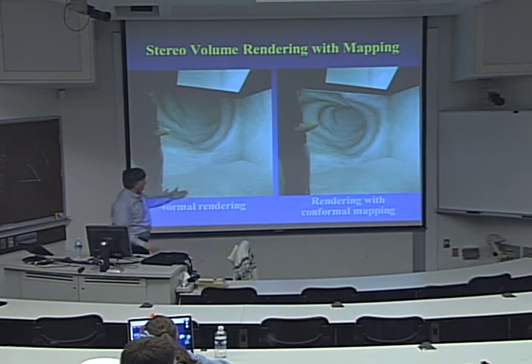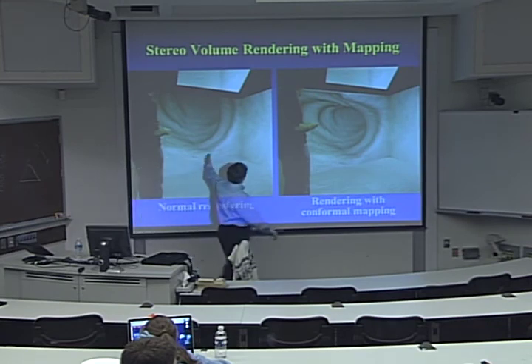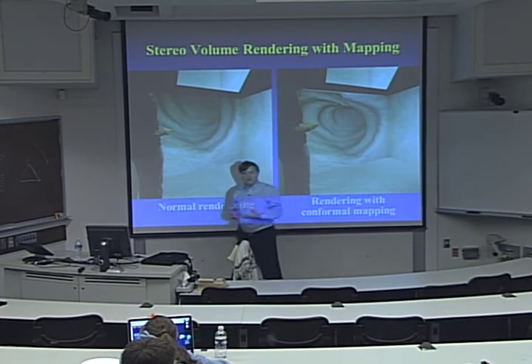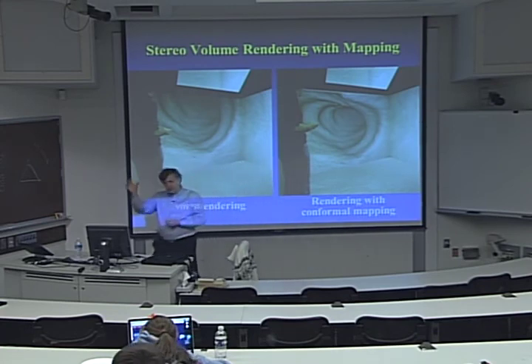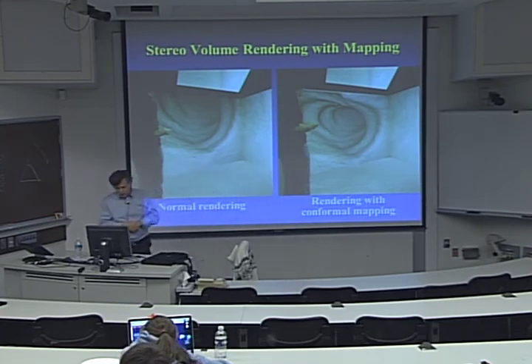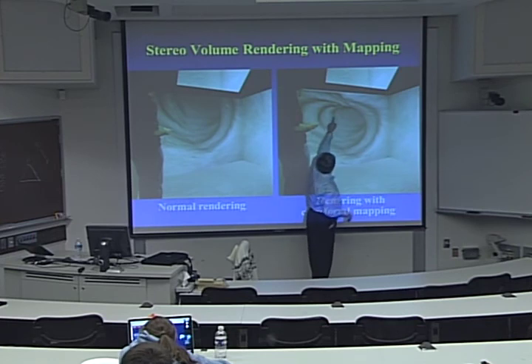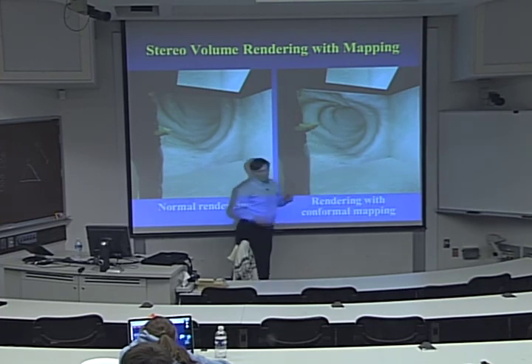So that would look like before we squeeze the ceiling in, and that's after we squeeze the ceiling. So you get the general idea of the same shape, and polyps will indeed show in this area, but we're not missing the ceiling. So you can see some bumps here that might be polyps or not.